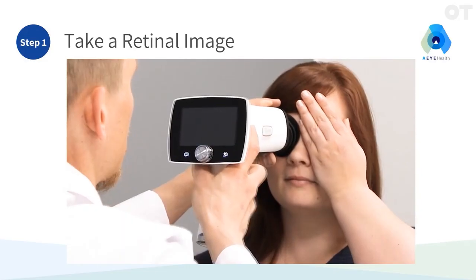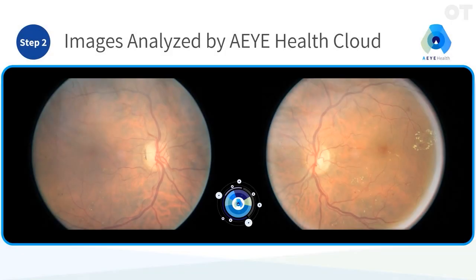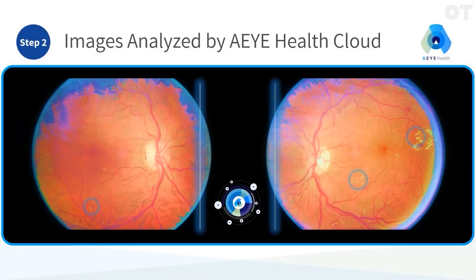The Aurora AI is our first handheld bundle, which is a handheld camera integrated with AI. Using that device you can screen your patients. It takes a couple of minutes, you have an instant report, and you're done.